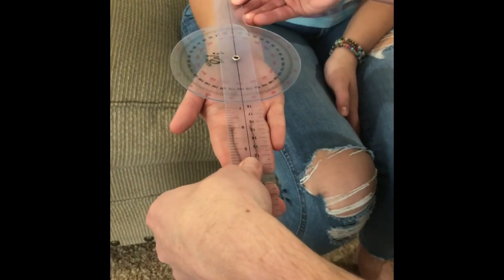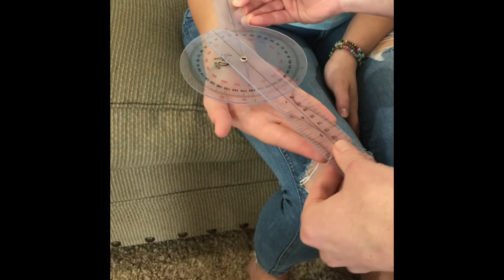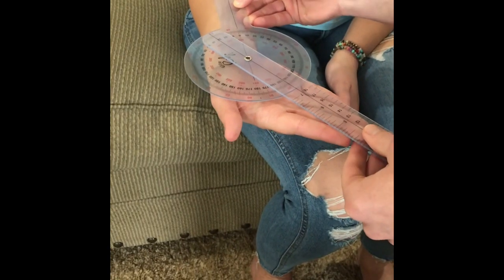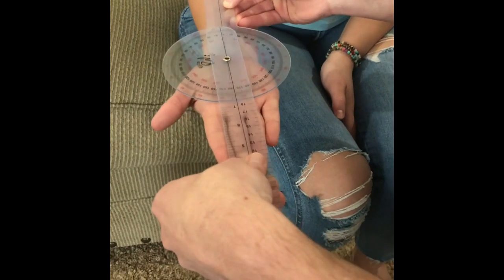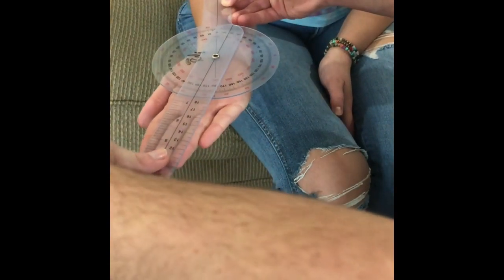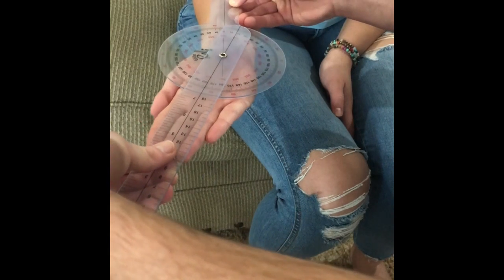And then you're going to have them do ulnar deviation as far as they can go to the left. Good, that's about 35 degrees, and go back to center. And now we're moving it over to the right as far as you can go. And that's about 22 degrees.